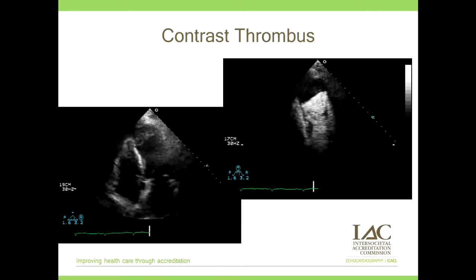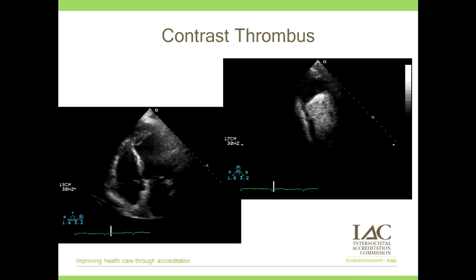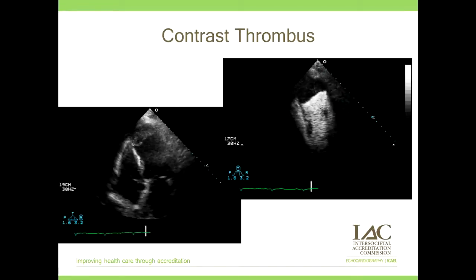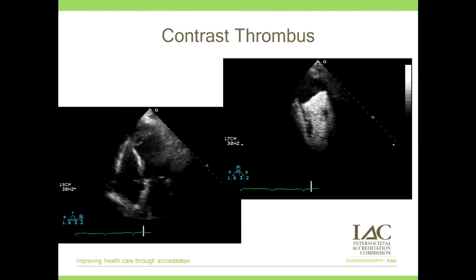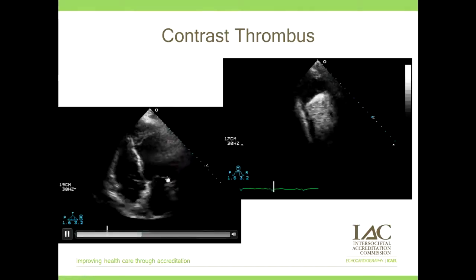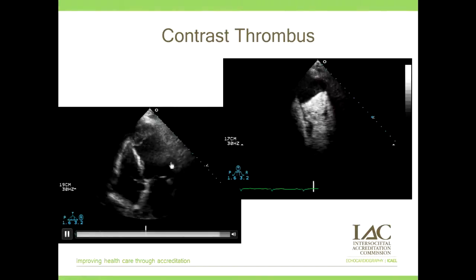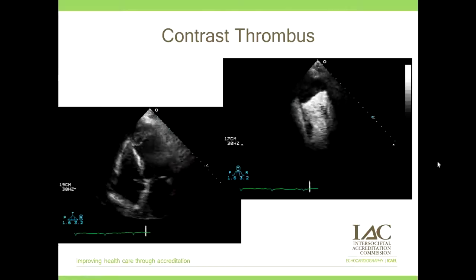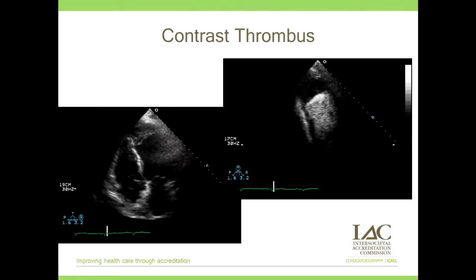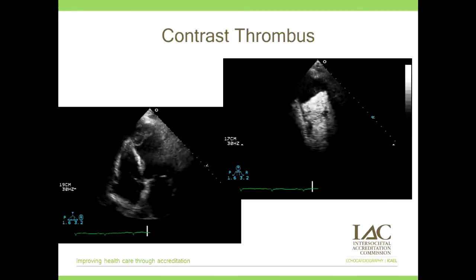Our next case is one where we utilize contrast for a thrombus in the apex of the left ventricle. You can see a fairly decent apical four-chamber view with a thrombus in the apex. The reason we gave contrast was because of the lateral wall of the left ventricle, where we don't see it as clearly. After contrast, you can better define the wall motion in that area, and it very nicely brings out the thrombus in the apex.